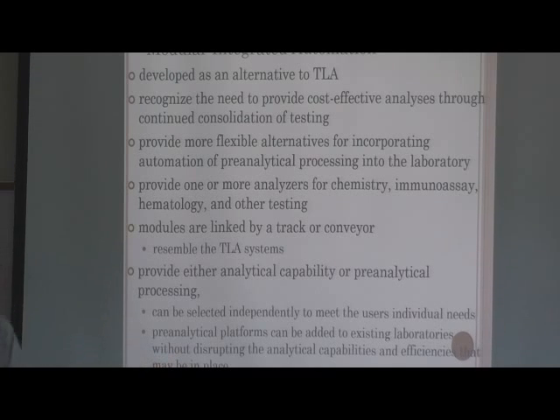And we're talking, so pre-analytical is basically where you take the tube, right, and you identify it, you enter it into the information system, scan it, and enter what tests it needs, or if you scan it, it does that. So that's like the pre-analytical phase. And they have those at North Florida too, I believe.